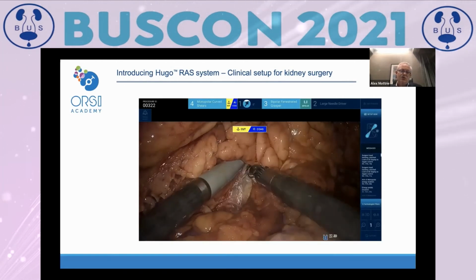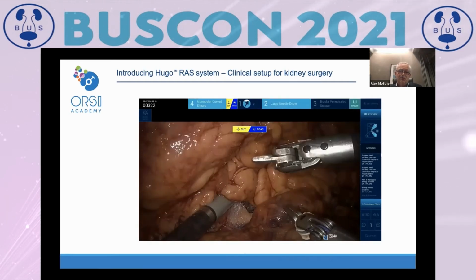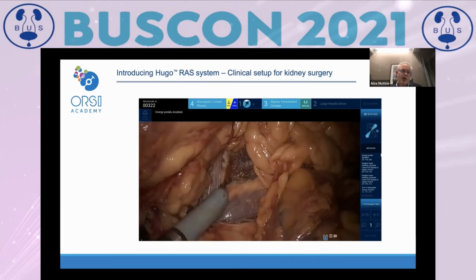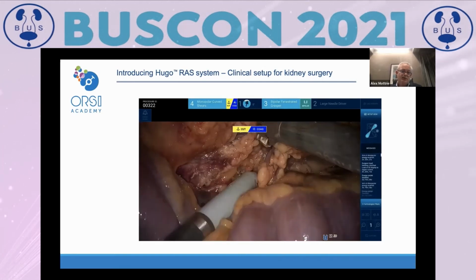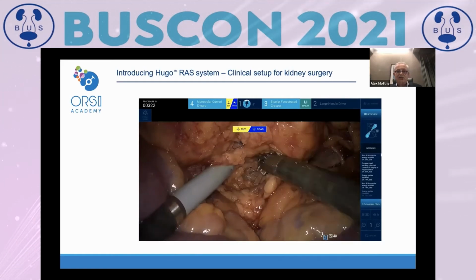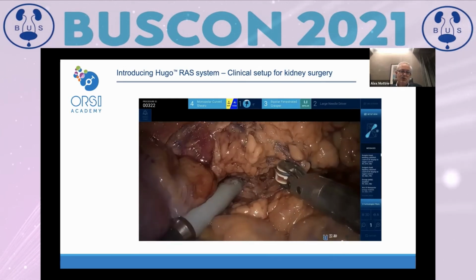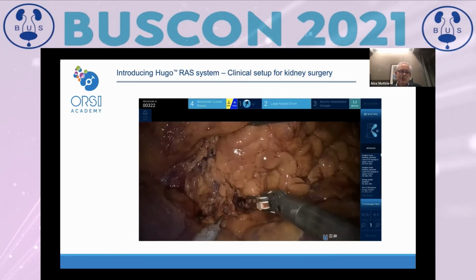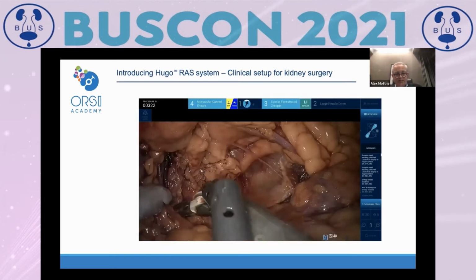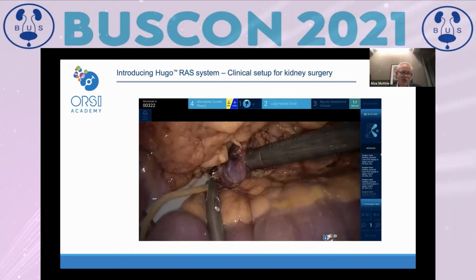We feel very comfortable. It is a very stable system, and it makes it easy to use. The way you are doing it today can exactly be copied without any problem. So the idea is that we follow the natural paths towards the vessels. Here you see that we are isolating the vessels. Please remember that this is a cadaver, so it's not because my surgery is so bloodless, but we always hope it is, but here of course it's on cadavers.